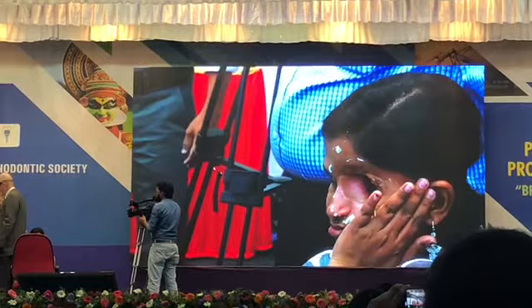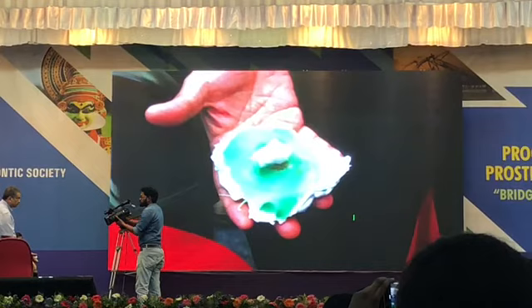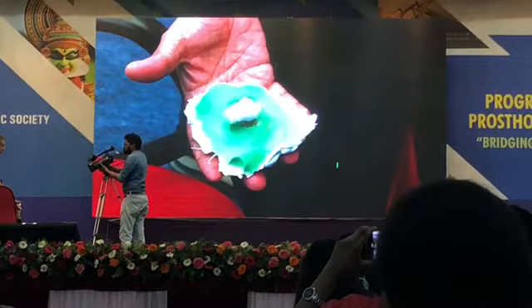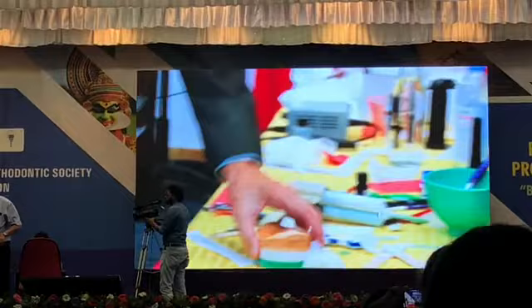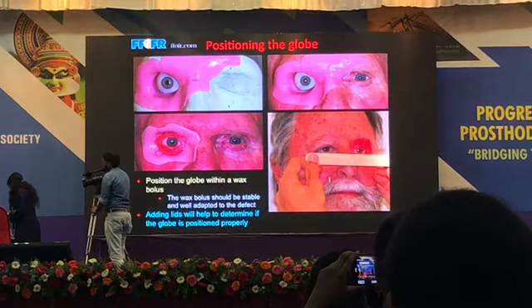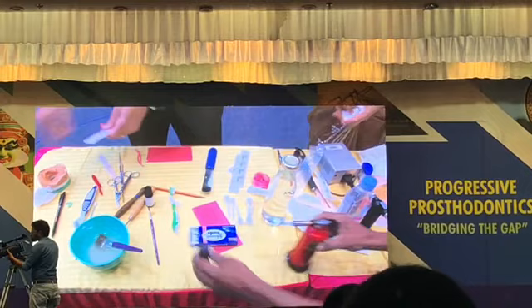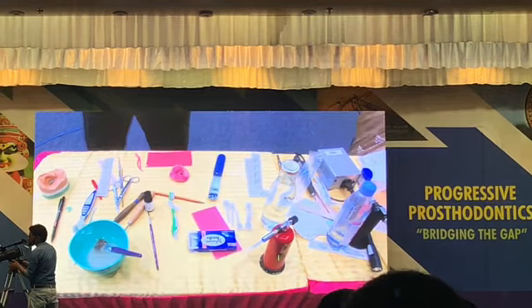So, whatever you want. Now, somebody clean her up. So we need to get her cleaned up a little bit. Okay, now I need the torch lit. You want to get rid of all of this stuff that we're not using. Okay, get rid of all of this. We don't want that. See, that's our marker. Okay, so let's get rid of all this stuff. Put that here. Go ahead and clean her up. Thank you. You're a good patient.